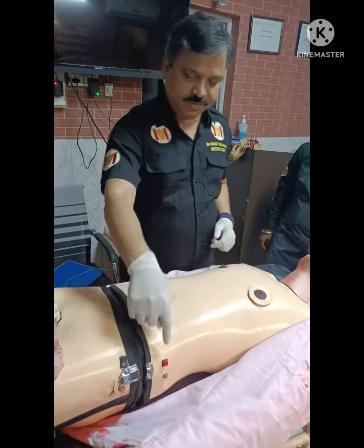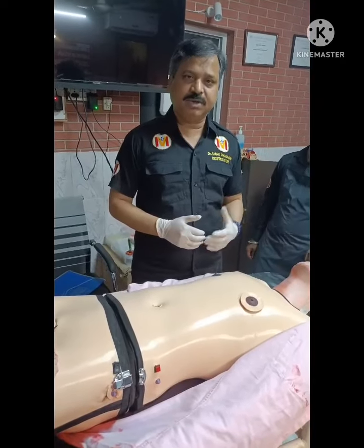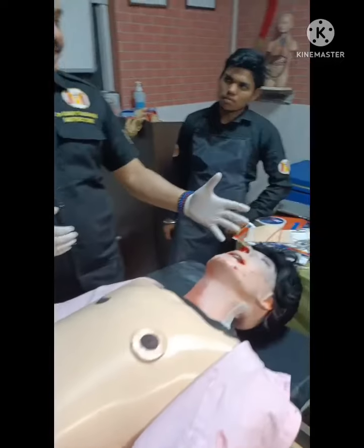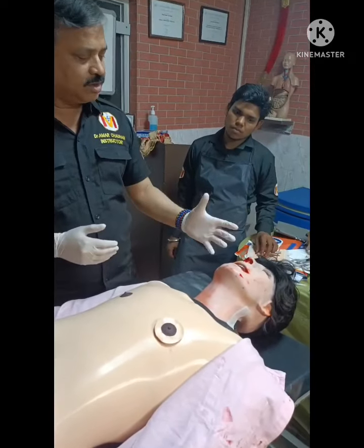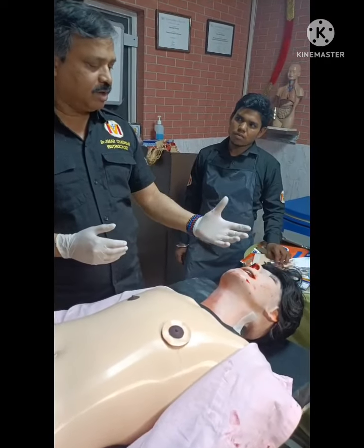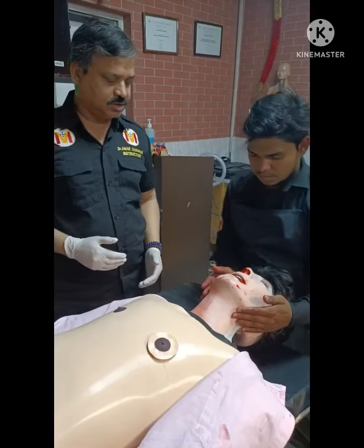If you switch on this button, he gives an audio signal that this patient is in altered sensorium. We are demonstrating a patient of polytrauma, and his breathing is not okay. He is snoring, probably because his tongue has fallen back, and now we will demonstrate on this Moulaged patient how to do a jaw thrust. Now show us the jaw thrust.